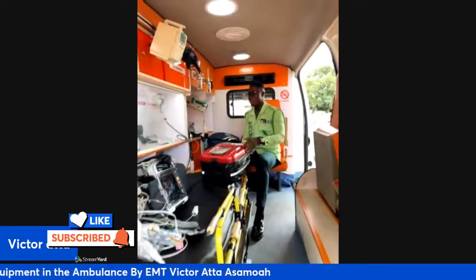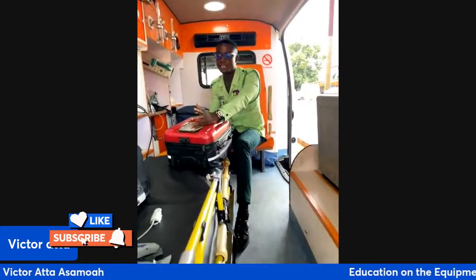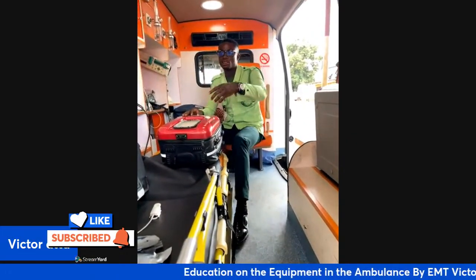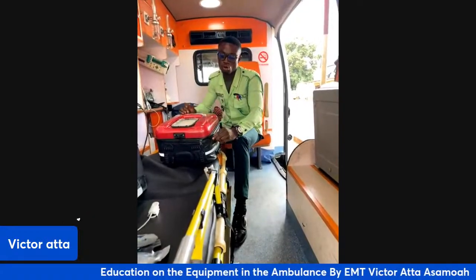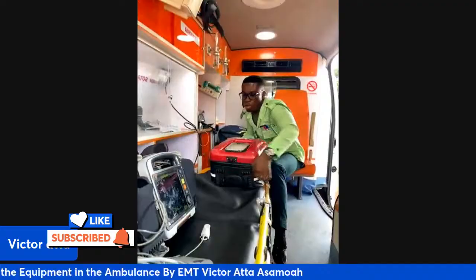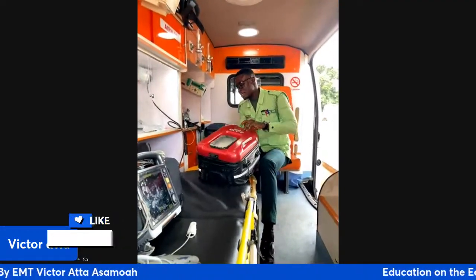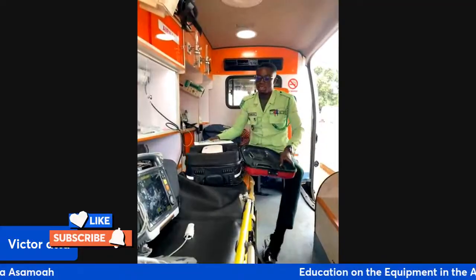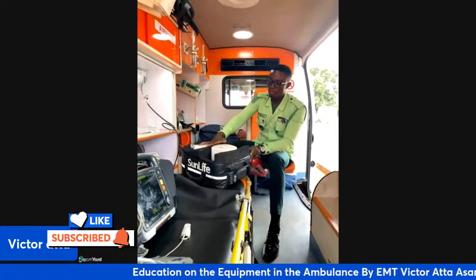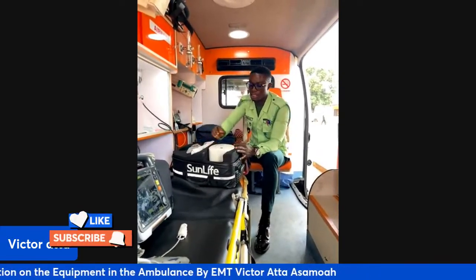As I said earlier, we are learning some of the equipment in the ambulance. We are done with the patient's cardiac monitor. We have the small type and then we have the big type. The small type allows you to know some of the vital signs in the patient, and the big one allows you to know plenty of the vital signs. It's more advanced. So we are moving on to the automated chest compressor. This is Sun Life.